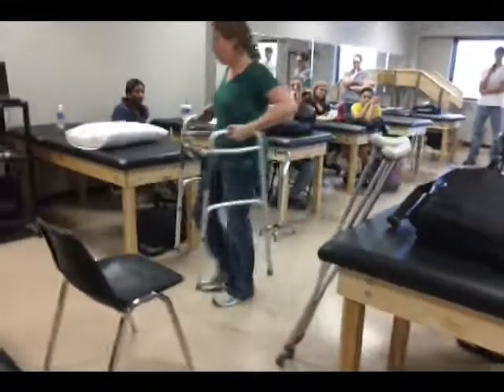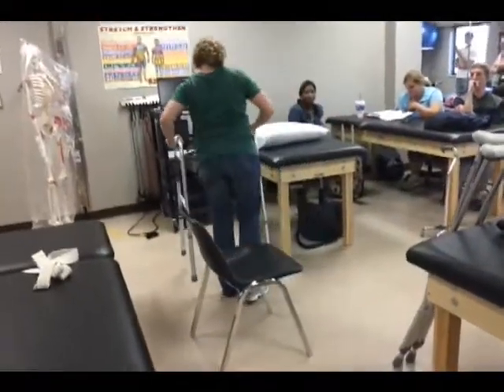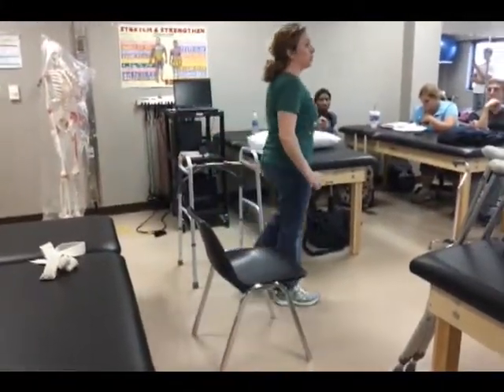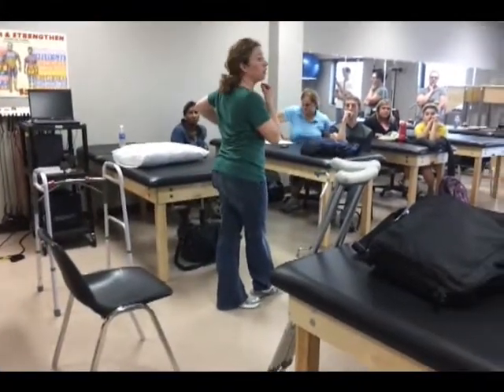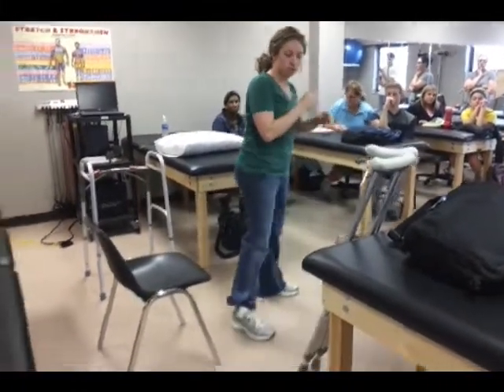If I am partial weight bearing, what can I choose? Modified 3-point. I can use a modified 3-point.